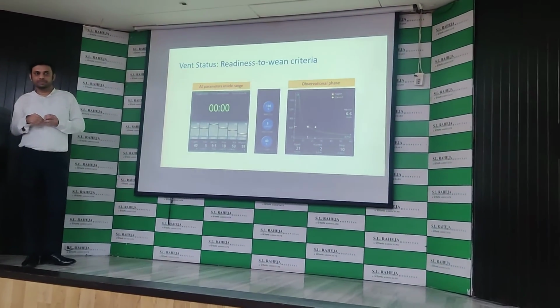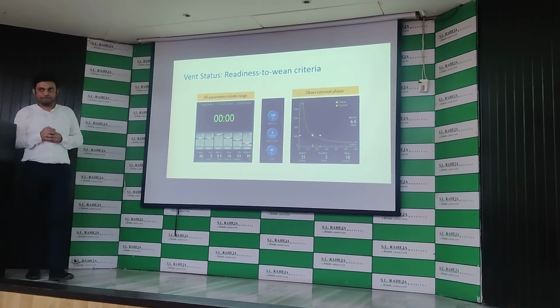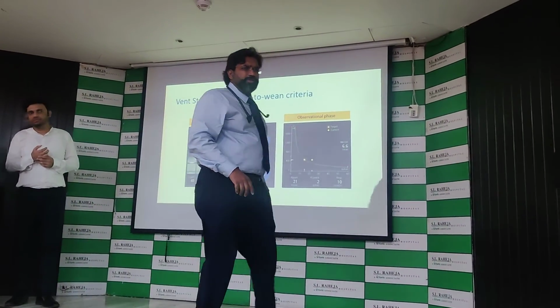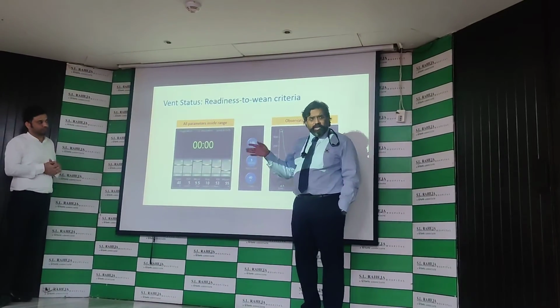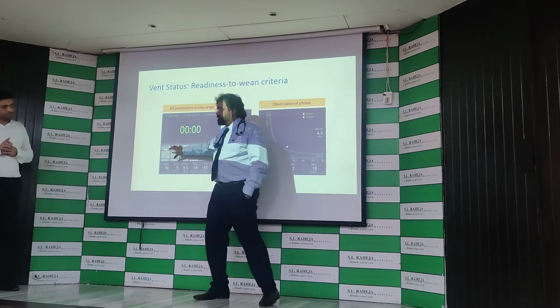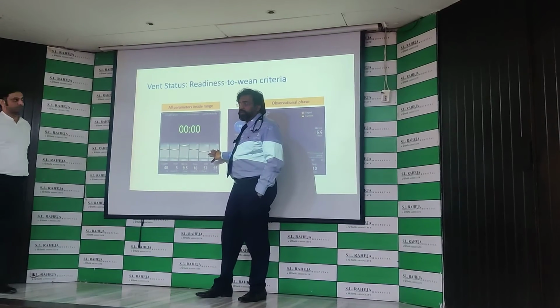As far as I found, the Hamilton G models also have a very similar feature, the G5 or Galileo. The graphics were different. When this comes into this bar and all of these remain adequate, how do they calculate this adequacy?